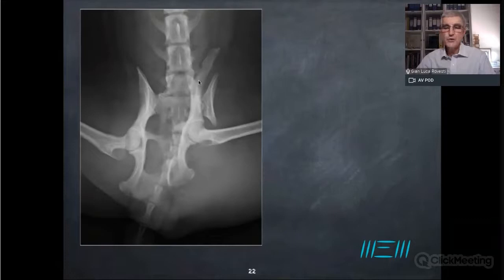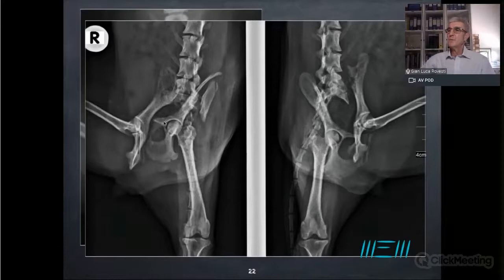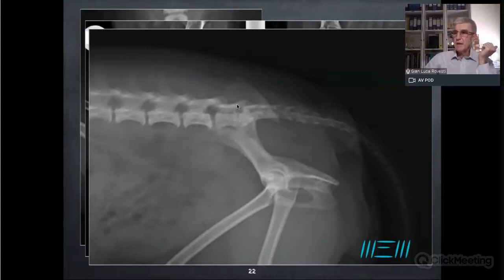As always, if I want to better understand how is the fracture, I can perform these oblique views of the pelvis, and here you can see how long is the fracture line here. And the displacement, cranial displacement. Okay, this is very useful. So we need some strategy in order to stabilize this kind of fracture. Here, to stabilize the fracture with a plate wouldn't be that easy, okay? And the reason is because the plate has not a good purchase on this small fragment, okay?